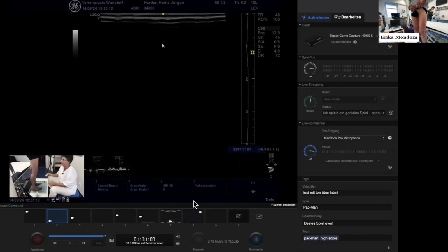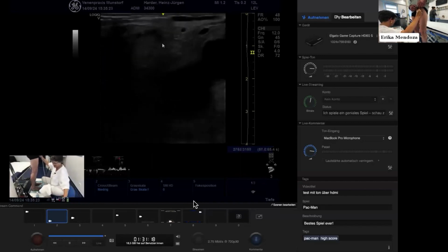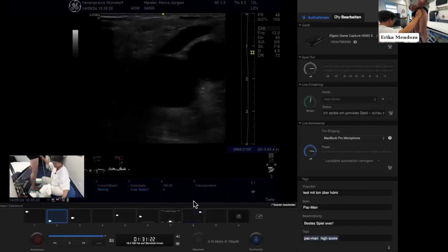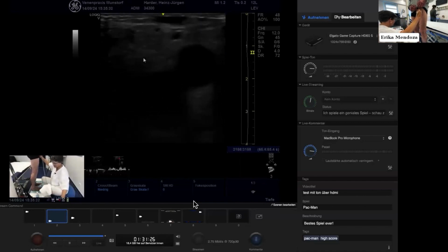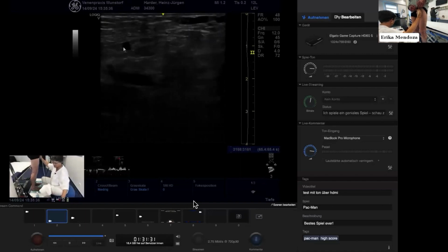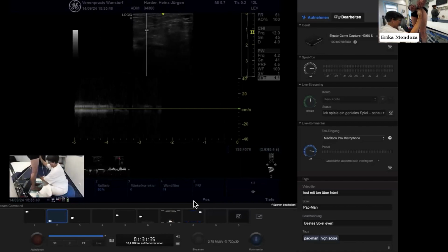Can I play the devil's advocate in this case and just ask, can it be an element of pelvic congestion syndrome in this patient, or do you think the reflux is only from the saphenofemoral junction? I think it is really only the saphenofemoral junction in this place. You see, it is very, very obvious that it comes out here, but we can just have a look. This would be the epigastric vein. Yeah, is it not the superficial inferior epigastric?